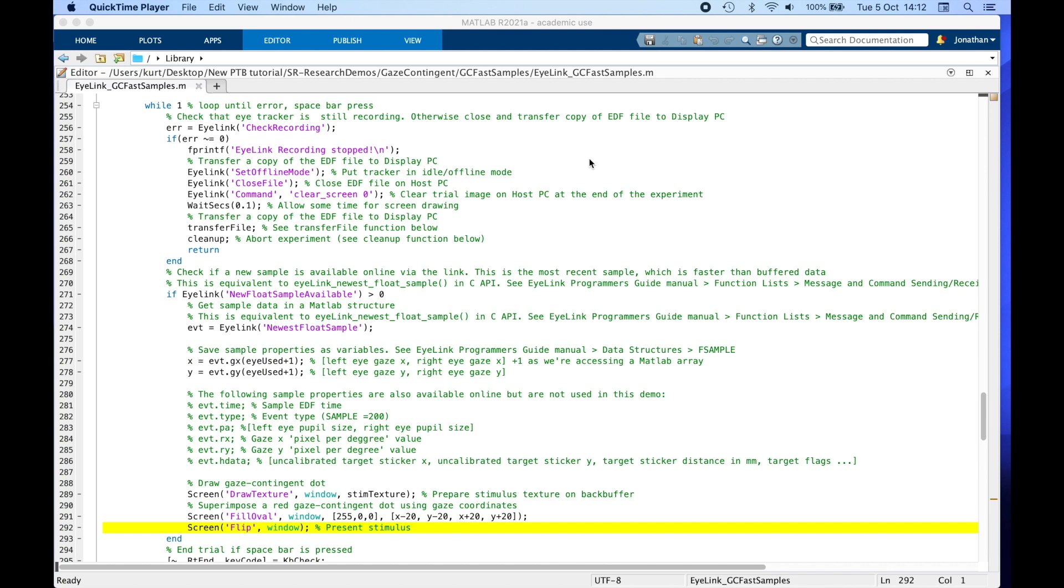Note that the while loop will iterate only once every screen refresh. In the meantime, there can be many gaze position samples in between that are ignored, but this is fine as we only need a sample just before we update the screen with the new location of the red dot. And we still have access to all gaze samples saved in the EyeLink data file if we analyze the data post-hoc.